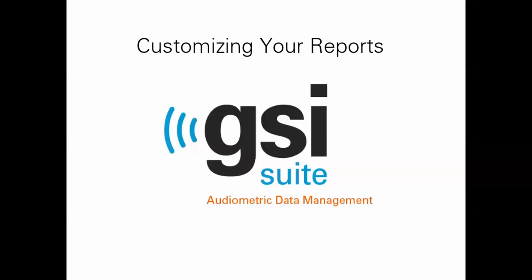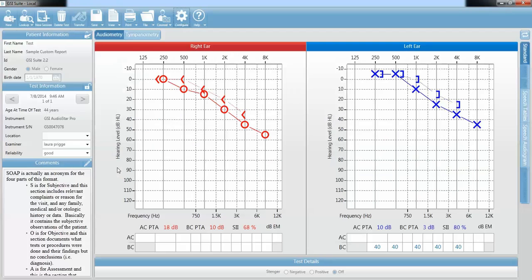My name is Laura Prigge, and I am going to talk to you today about the GSI Suite Audiometric Data Management software and how to customize your reports. If you open your GSI Suite, you will notice that all of your data has transferred into the software from your AudioStar Pro, TimpStar, your GSI 39, and now we need to figure out how to customize the report so that it looks the way you want it to look.